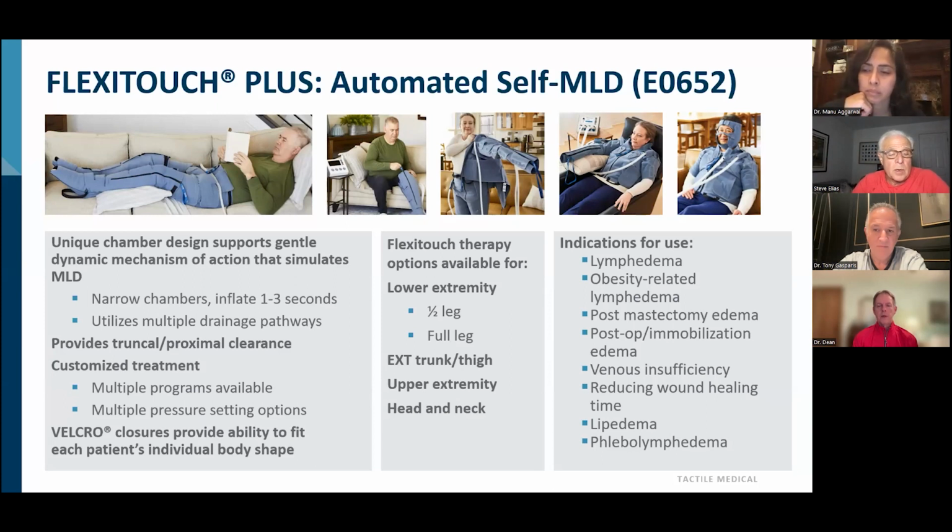It's a little more programmable compared to the Entre device, and the Velcro closures allow for some extensions. If you have fairly large legs, you can fit it to each patient's body type. Go ahead, Steve.